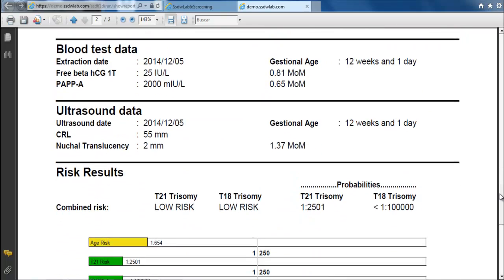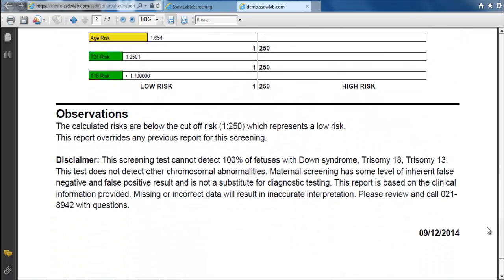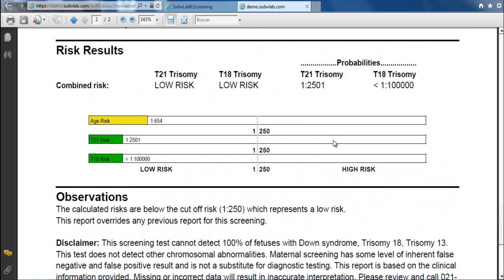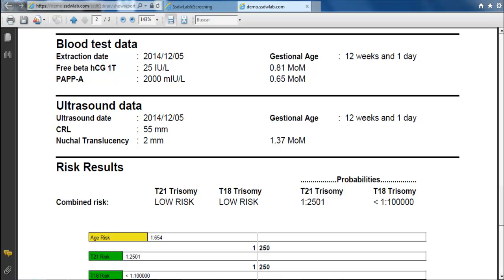What we see is what will be reproduced in the printed report. We can see represented in bars risk for trisomy 21 and risk for trisomy 18/13. Following these steps we performed a combined first trimester screening.